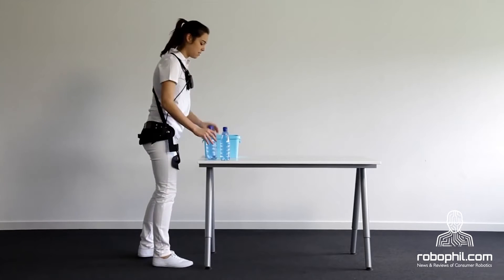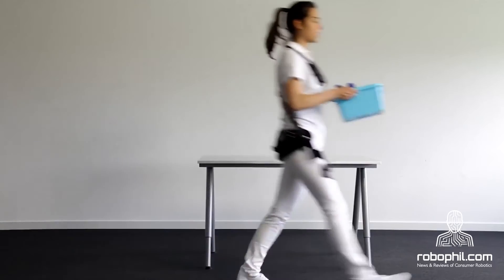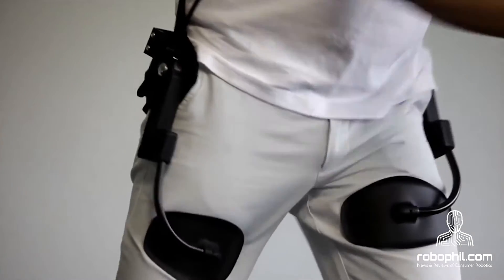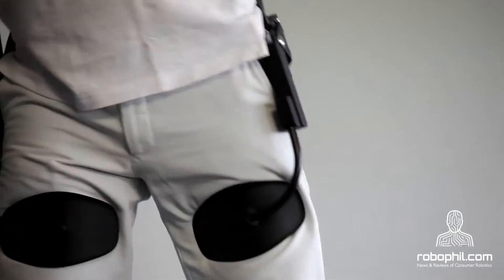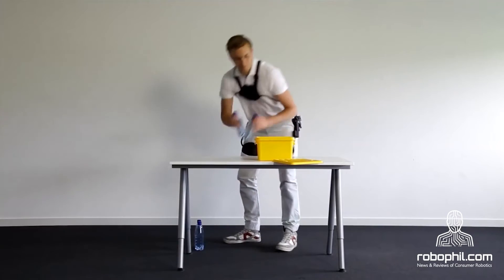Two, the chest pads are designed in such a way that the pressure is comfortable, even after a full day's worth of work. Three, the flexible structure moves with the body, allowing sideways lifting and short walks, and providing a spring force while bending.